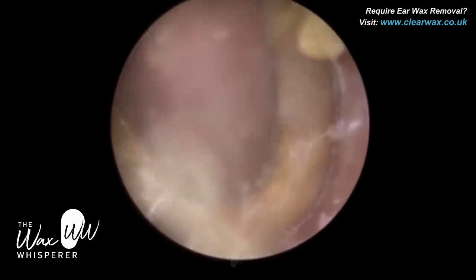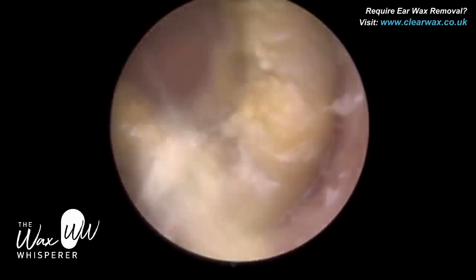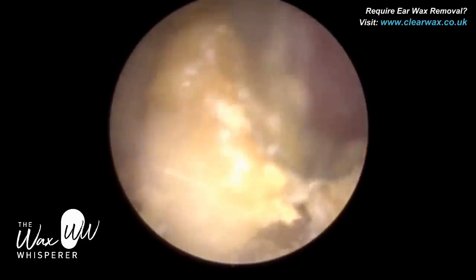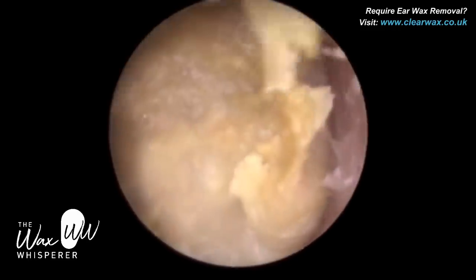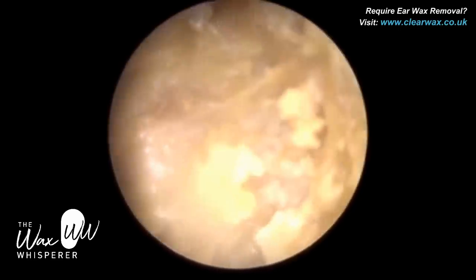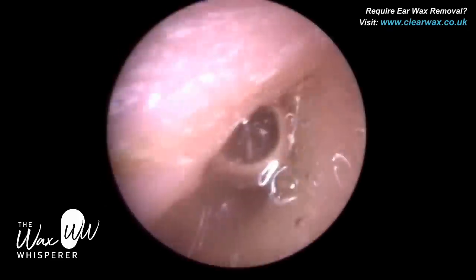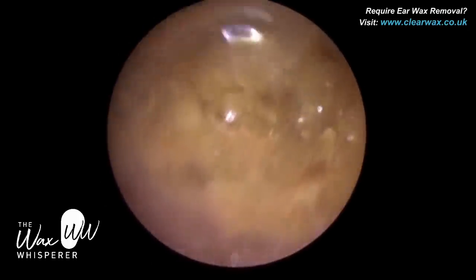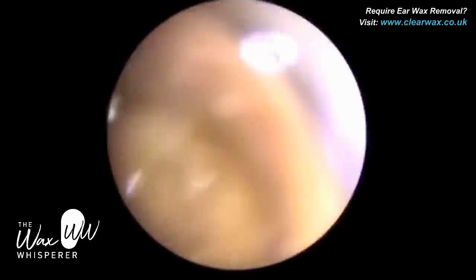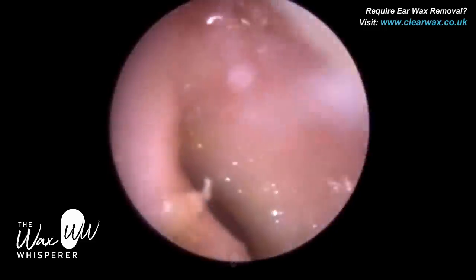If we can loosen that, it helps remove the plug of wax that much more easily. I'm just at the base of the ear canal, trying to lift this off the inferior canal wall. Part of the problem with soft, mushy wax is that rather than suctioning the wax, the suction probe itself just makes an indentation in it. It's very difficult to use instrumentation like an earhook or forceps — the wax is just too soft. A Jobson horn would be partly suitable, but because the wax is fully occluding and extending from the entrance all the way to the eardrum, the Jobson horn is only effective for the more lateral layer near the entrance. As we go more medially on the bony, sensitive part of the ear canal, we want to avoid making contact with the canal wall wherever possible, and that's not always possible with a Jobson horn.